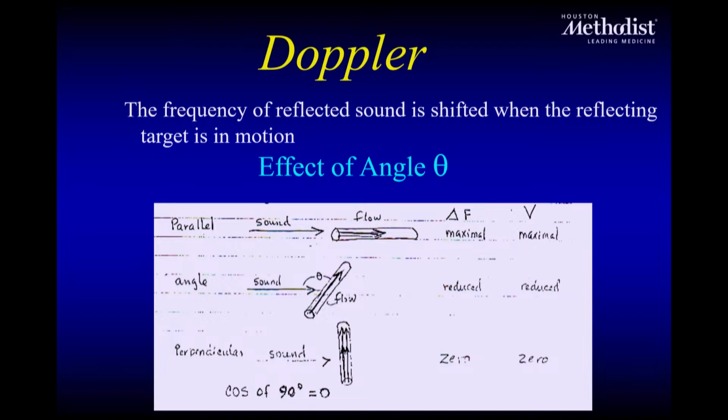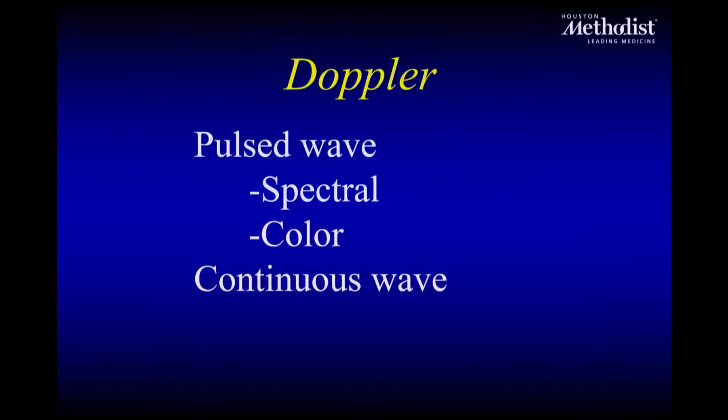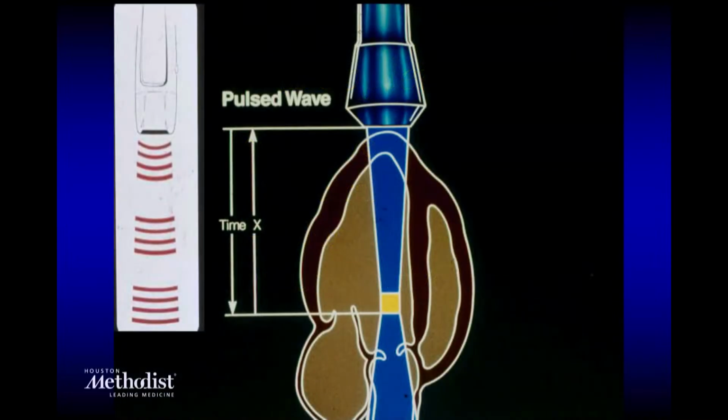At times you'll be fooled because I see a jet by color and I put a cursor, but you never know which direction this thing is going, but color is probably the easiest one. Once you see a direction of a jet, let's say a mitral stenosis, and align yourself, I think this is the one that you'll have the least issues with. So keep that in mind, particularly the ones that you cannot determine what it is. Okay, so let's go through some examples.